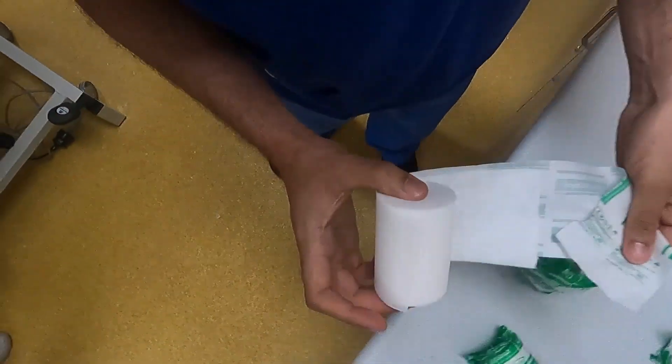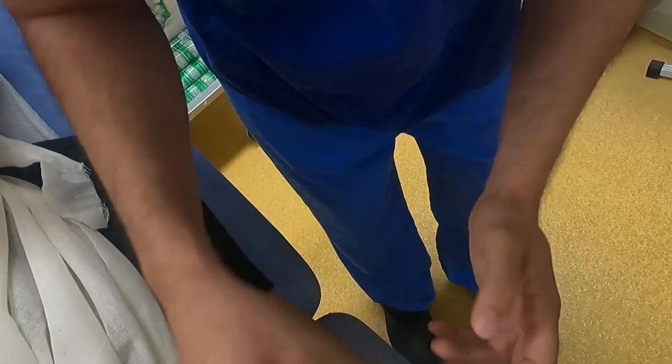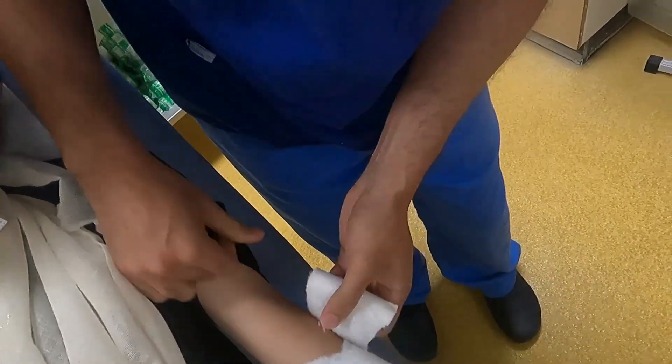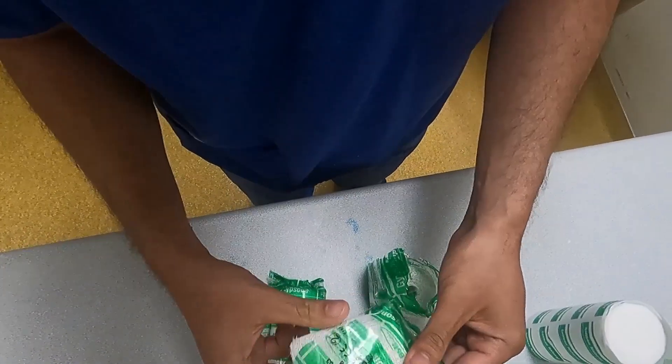4 inch tubular wool is then applied below the elbow. My personal preference is to apply the plaster in stages so that the fracture can once again be manipulated, with a single roll of plaster of Paris and then reinforced with further rolls.